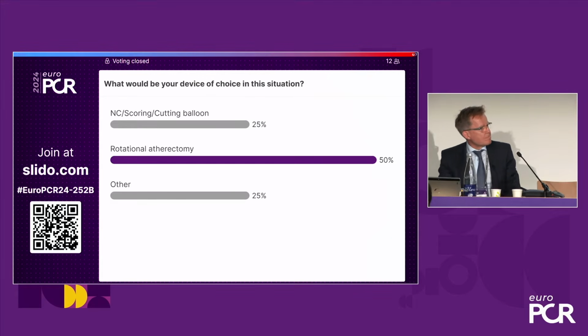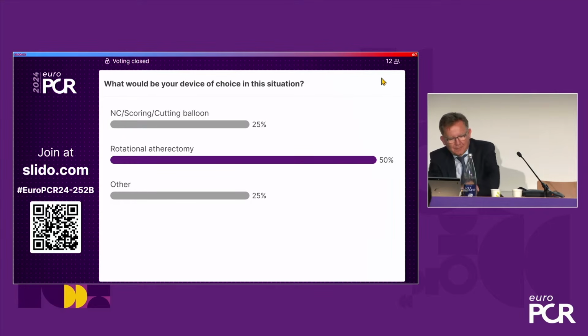Alfonso, would you have the laser machine already booted up at the start of the case? Yeah, I would have done that.